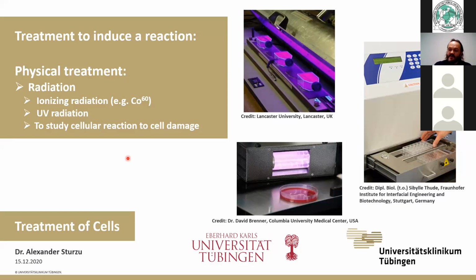And at this point, I can mention another physical treatment that you can do with cells, which would be temperature variation, but this is a little moot because it is well known what happens with temperature treatment. If you go beyond 42 degrees centigrade, your cells will denature and die. And if you go lower than the optimal growth temperature of 37, the metabolism will slow down. But until you reach the freezing point, you won't have any adverse effects other than slowing down the metabolism.